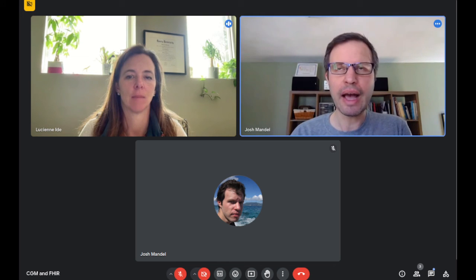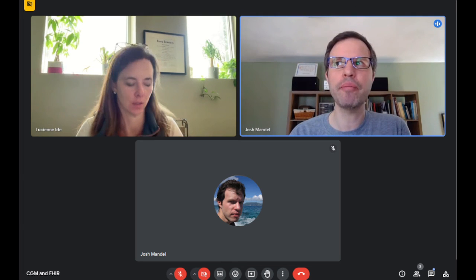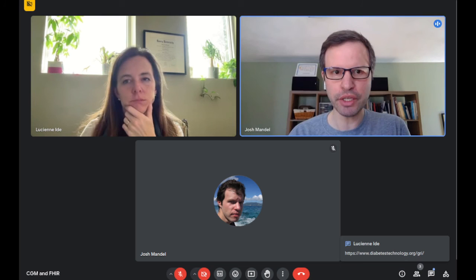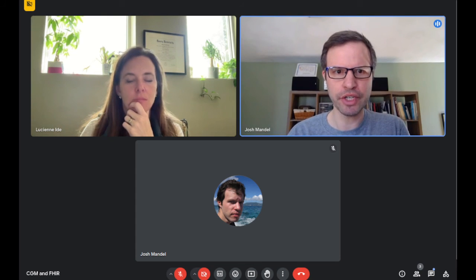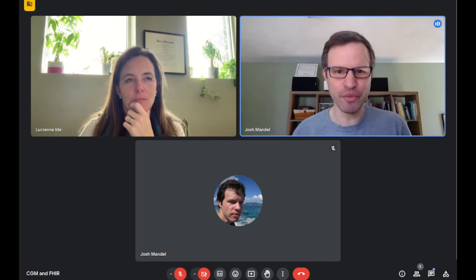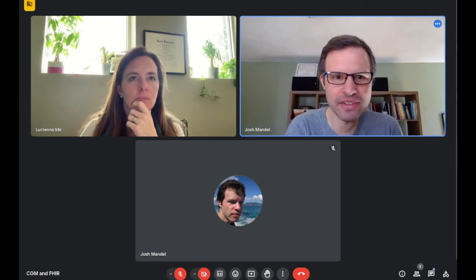So the data curation person in me thinks the best thing to do would be just to store the timestamp data. There's not actually that many of them. I think every 5 minutes for the current generation of sensors. And if you store those, you can later recompute any metric you want from them. Why is that not the right way to focus a project like this? I can think of some reasons, but I'm curious what you'd say.